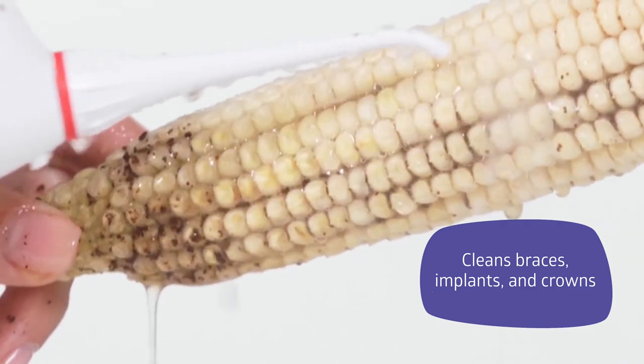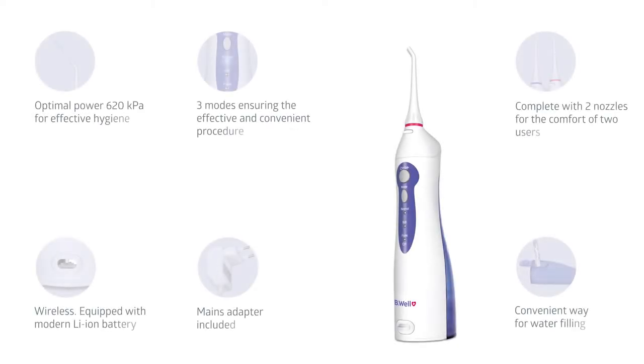It is the most effective irrigator for cleaning the mouth cavity, even with braces, implants, dental bridges, and crowns. The Be Well WI 911 ensures the optimal power of 620 kPa for complete cleaning.